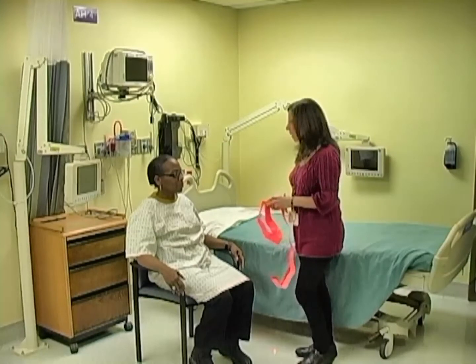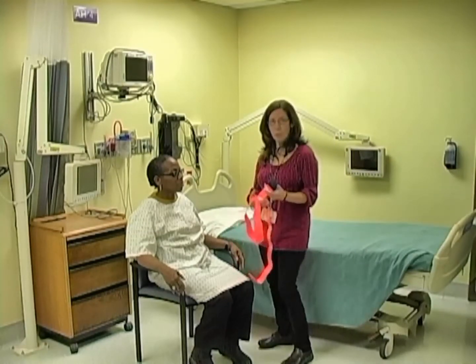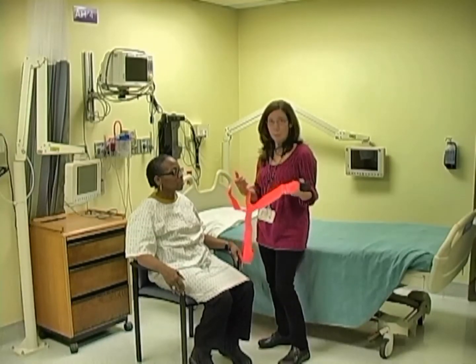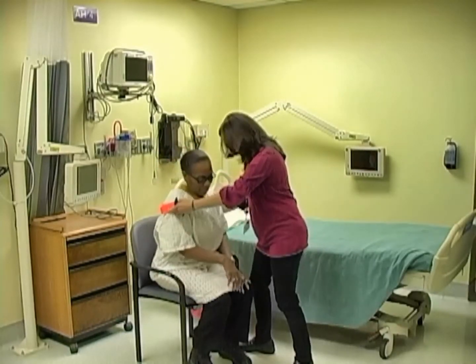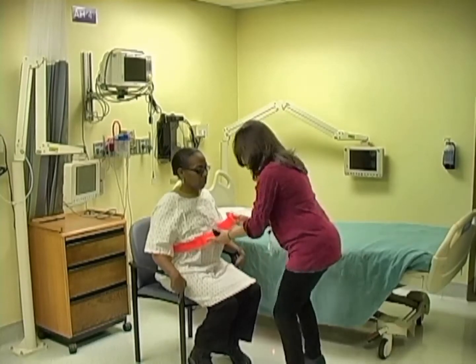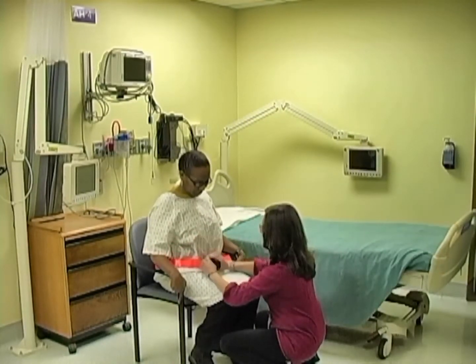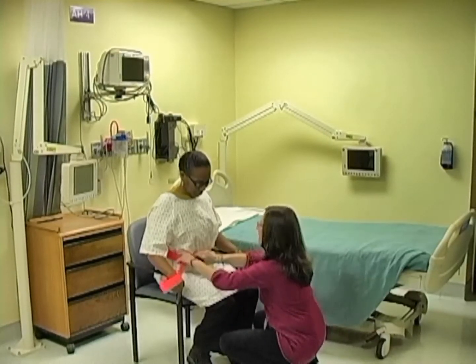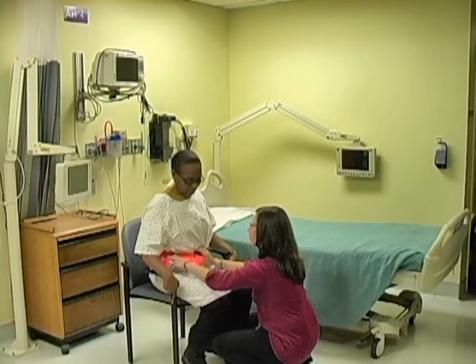When we're ready to ambulate a patient, we want to make sure that we use the plastic sanitizable gait belt that we can use between patients. The patient needs to scoot forward to the edge of the chair. Put it around their waist, a little lower. Keep your back straight. Right on your waist, nice and snug, because otherwise, once you stand up, it's going to come off loose.